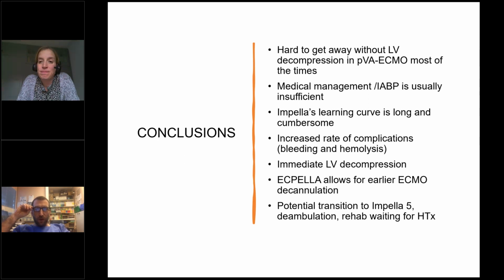Okay. Now, I'm not quite sure. Some centers who will do VA ECMO in acute heart failure may not be using PA catheters. Are there any substitutes that we could use in terms of echo criteria that could tell us the same thing as the pressure measurements that you mentioned, Clara? Definitely. There are a lot of estimates of wedge pressure by transthoracic echocardiography in the literature, and those could be used for the patient on ECMO. You can look at the diastolic function, you can look at the worsening of the MR on these patients, and even if you're not able to estimate precisely a wedge pressure on echo, if a patient is stopping to open the aortic valve and the ventricle is full of smoke, you have clear indications there that you're not unloading the ventricle and you're going to run into trouble.